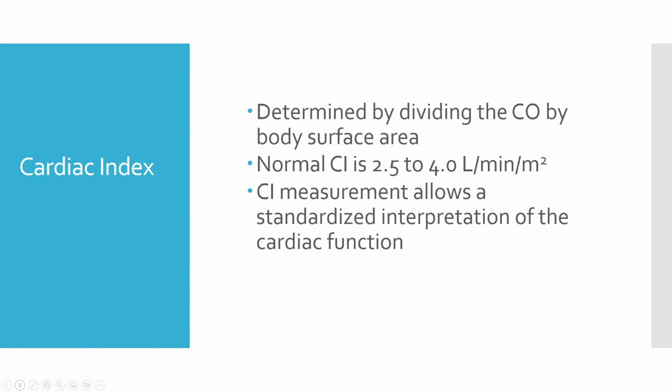You're expected to know that, but you're also expected to know that if the cardiac index on a patient is 2.3, it's somewhat low. Beyond that, consider what kind of symptomatology the patient might be showing and what hemodynamic measurements you would expect. Most commonly in left heart failure, you would expect the pulmonary artery pressures and pulmonary capillary wedge pressures to be significantly elevated.